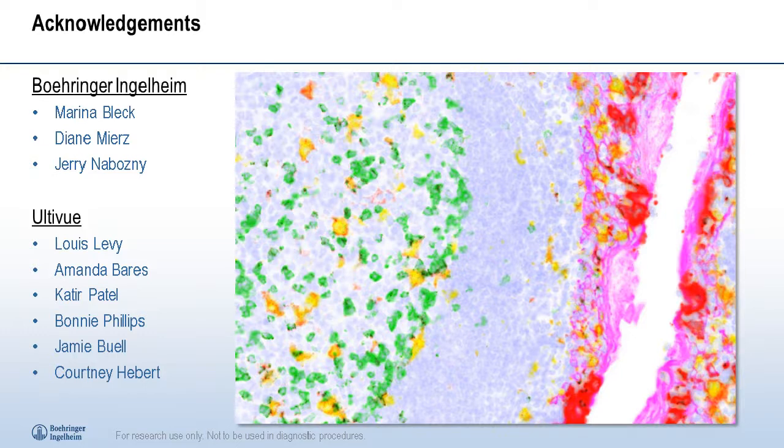Thank you, Alex. Here, once again, this will very much depend on what you've experimented with, but they ask how much variation is there between fresh frozen or paraffin embedding section and rat versus human tissues if you're using Ultivue's technique? I don't have any experience with fresh frozen yet. All of the antibodies are FFPE optimized antibodies, so all of my experience is with paraffin embedded sections. And we have not looked at any other species other than human because the existing kits are all focused on human-specific antibodies. We haven't tested whether or not they're cross-reactive with rat, mouse, or other species at this point.